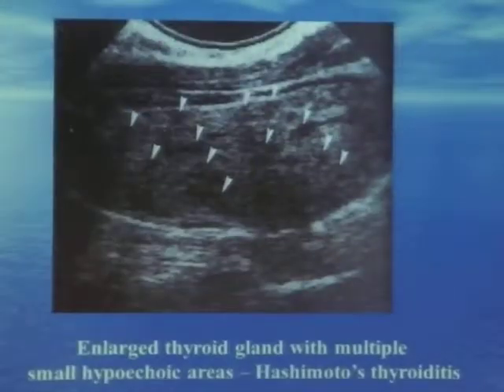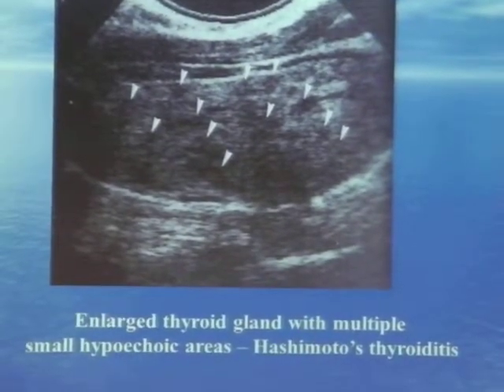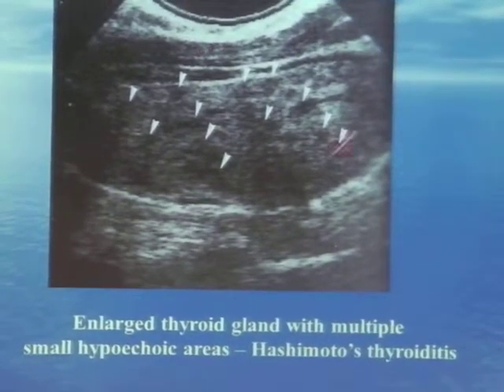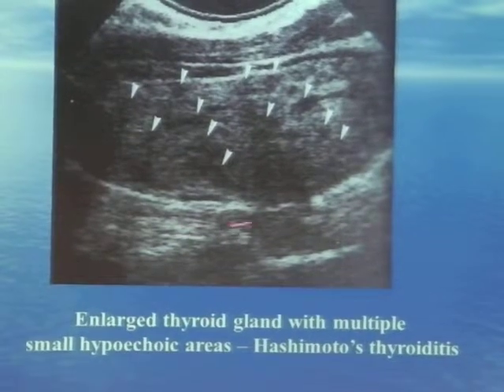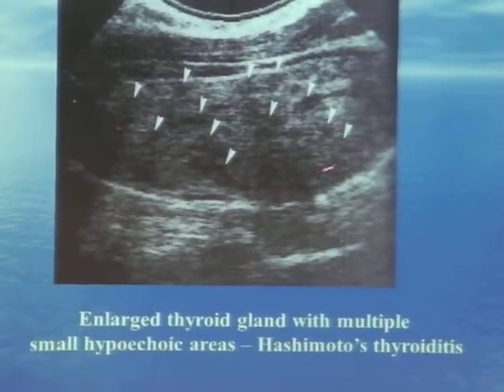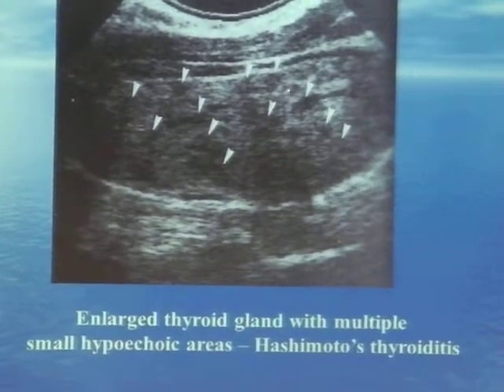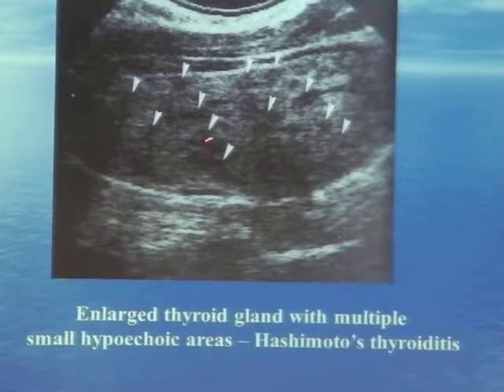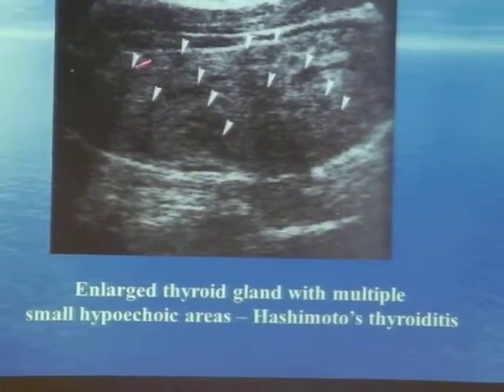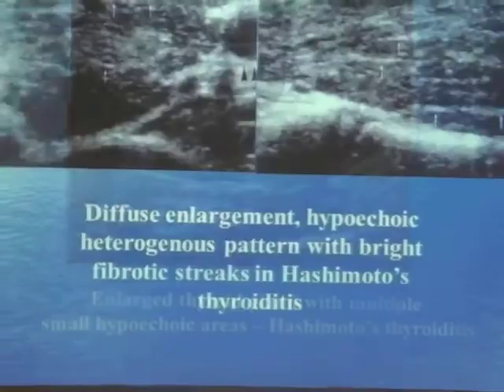All right, so let's look at this. So what you see is a Swiss cheese appearance. That's what I call it, right? So you have this really irregular, I mean, it's nice and round, yes, the whole nodule is involved, the whole lobe is involved, and what you see is these small dark spots all over the place, and this thyroid lobe is actually darker than normal. Right? So small, and this gives you the Swiss cheese appearance.